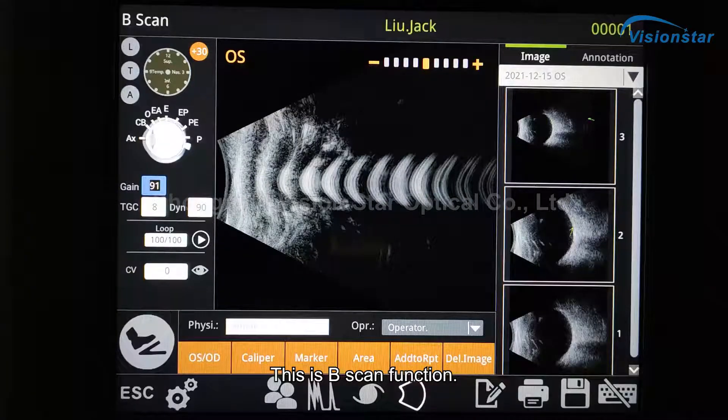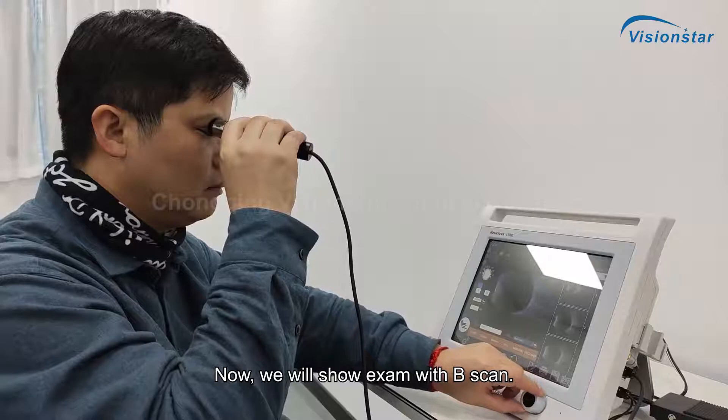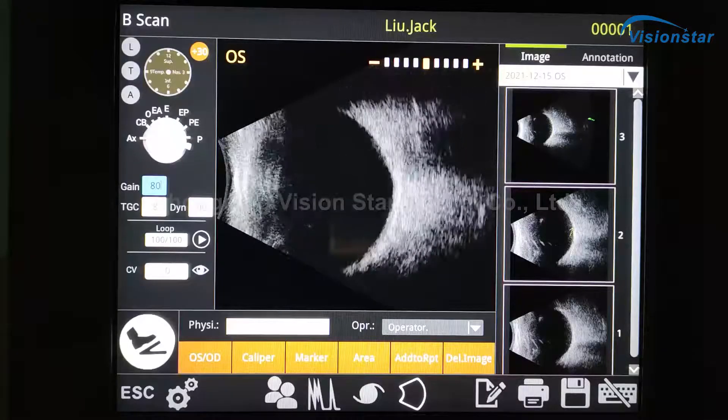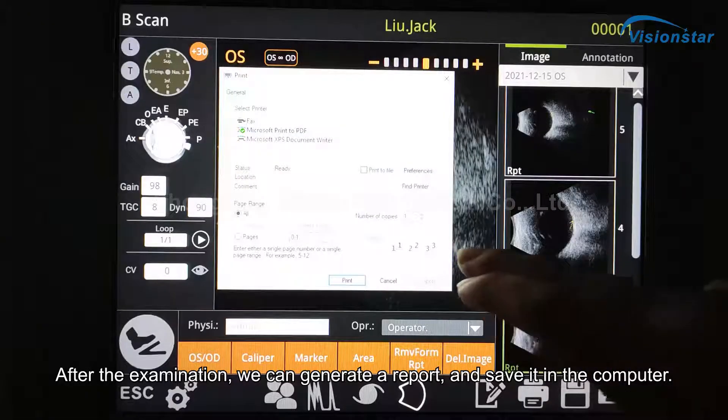This is the B Scan function. We will now show an exam with B Scan. After the examination, we can generate a report and save it in the computer.